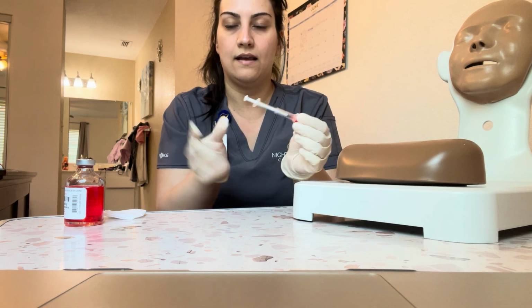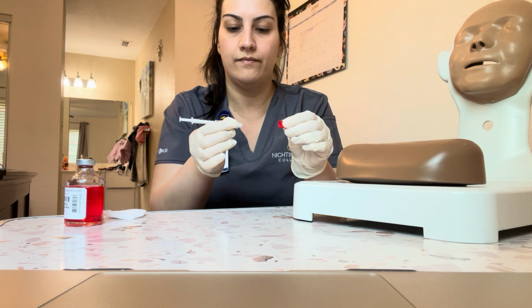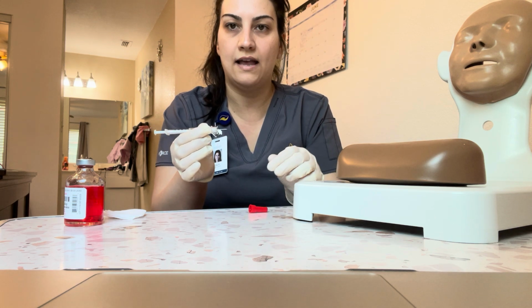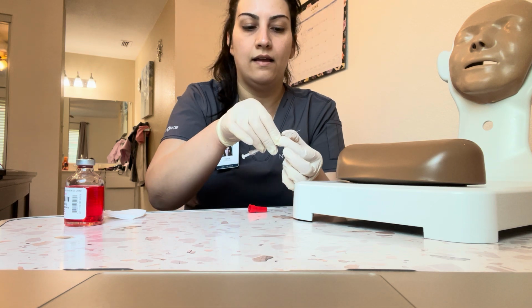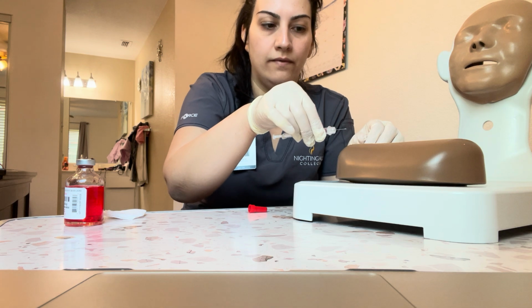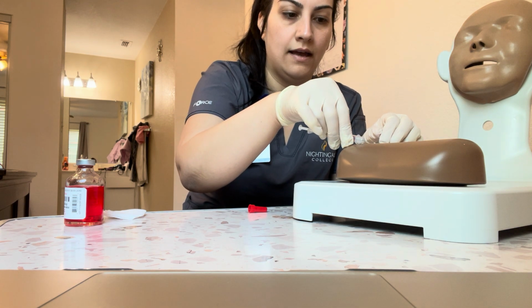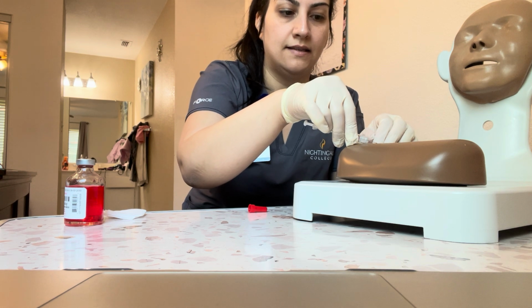And we're going to take these 2 fingers, take off the cap here. We're going to make sure that our bevel is up. We're going to go in at a 5 to 15 degree angle. We're going to feel some resistance. I do feel some resistance.